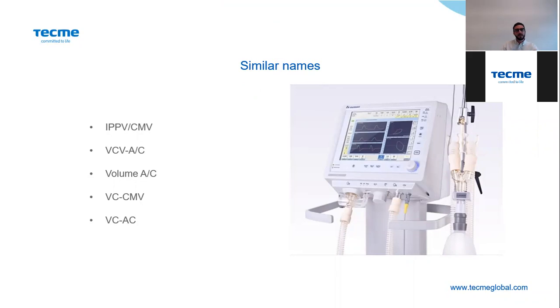So these are some similar names. We call it VCV, however, other brands call it IPPV, VC-AC, volume AC, VCV, VC-CMV. But the ideas are the same. The idea of the ventilatory mode, or how it works, is the same.